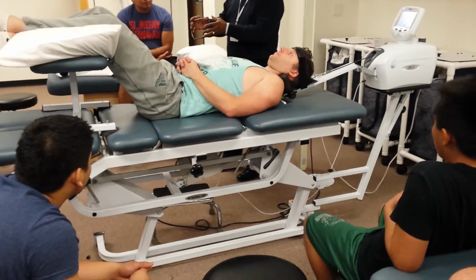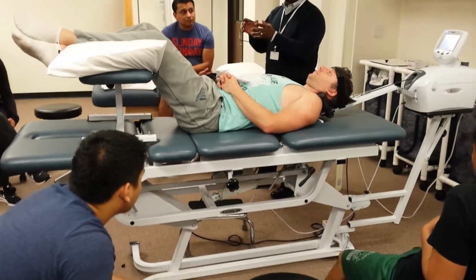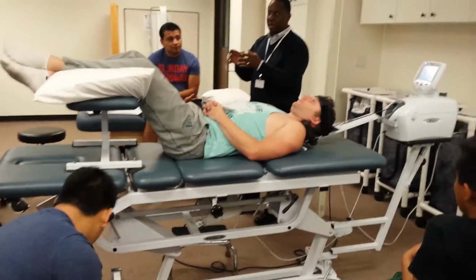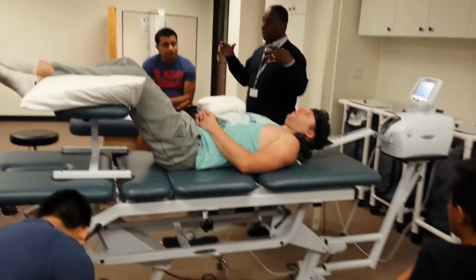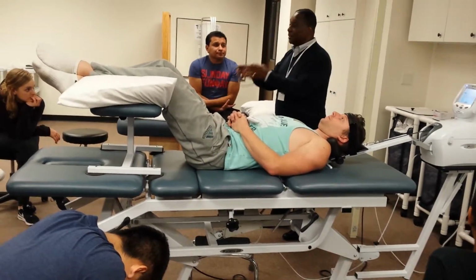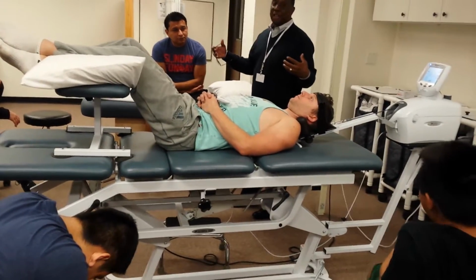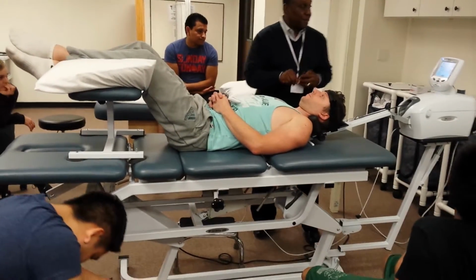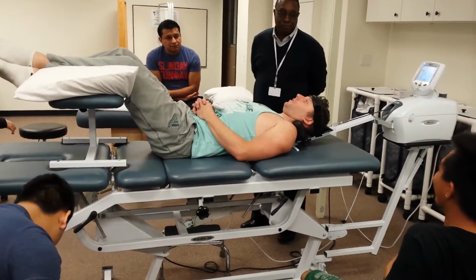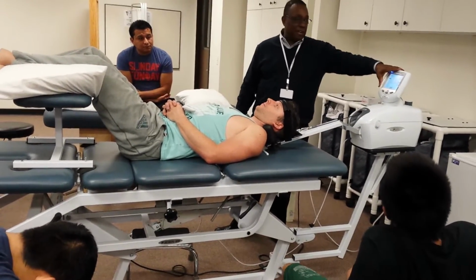It's going to go in through that process of, what is it called again? Hydrostatic. Hydrostatic versus osmotic, right? So hydrostatic pressure is going to create this sucking activity going into that space, and then the osmosis is going to push it back out. That's healthy, right? How are we doing so far? You made it through your first cycle. Good? Okay, so I'm getting used to this little crazy machine right here.